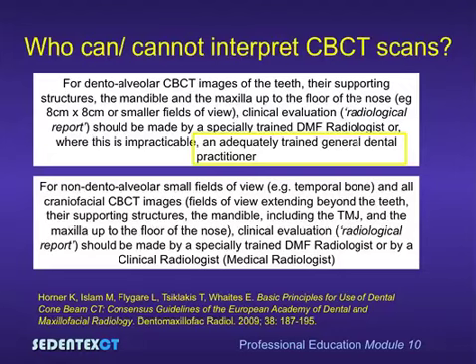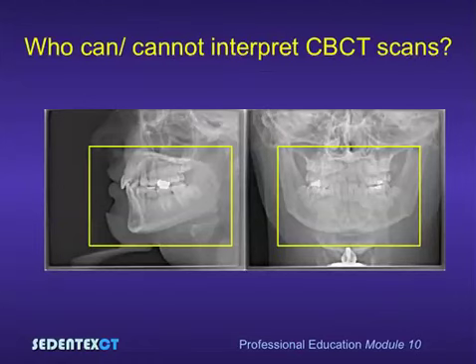The aim of this module is to try and provide adequate training for a general dental practitioner. As such, what we will contain within this module is broadly within the areas defined on these scout views from a cone beam CT examination.